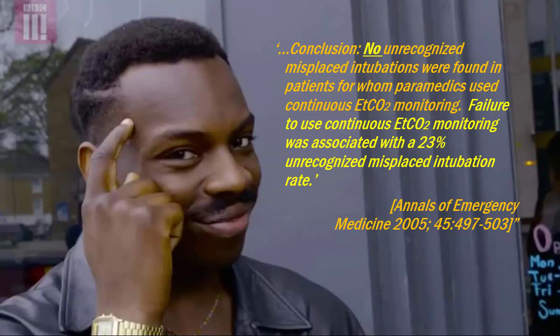And a combination of confirmation bias as well as the chaos of the scene and sometimes human pathology all resulted in paramedics who, well-intentioned, thought they had it in the trachea, and did everything else they're supposed to, still missing gut tubes. End-tidal CO2 is the only thing that is almost like a third-party assessment, a neutral assessment that will tell you assuredly whether you're in the trachea or not.